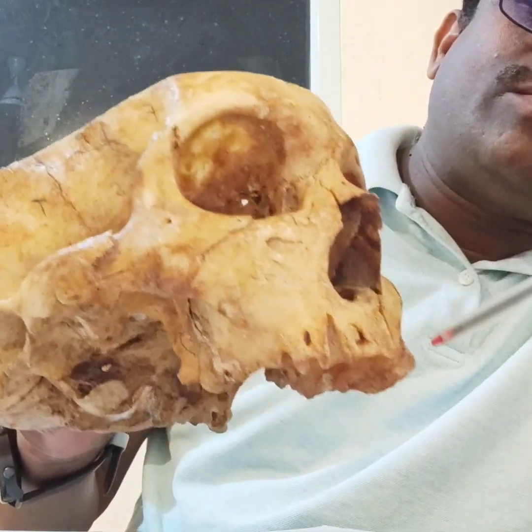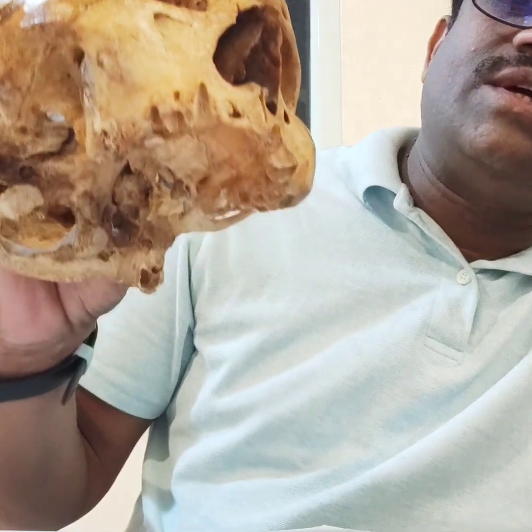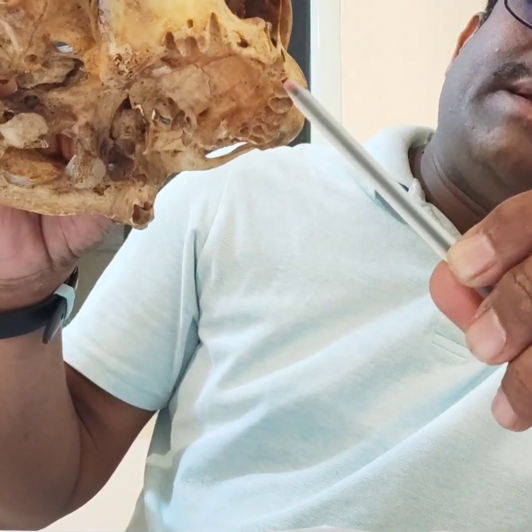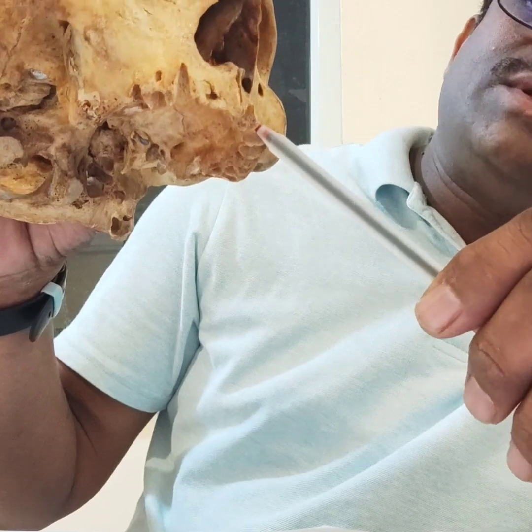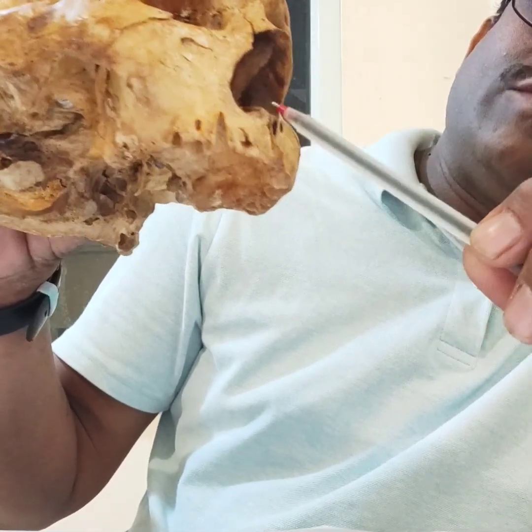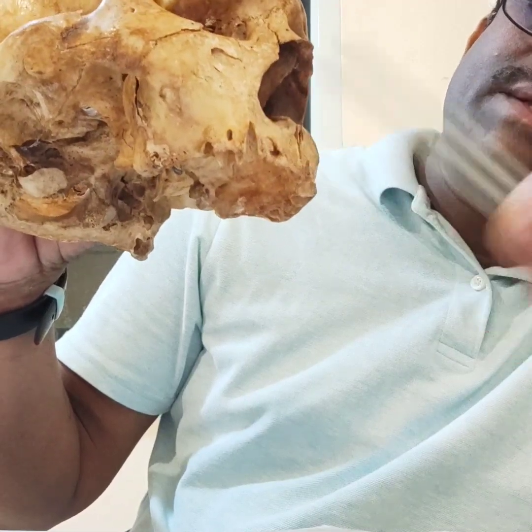You have to place a corticobasal implant. If you can engage your implant through the nasal spine, the stability will be good. So this is the nasal spine area where we have to perforate and place a corticobasal implant.